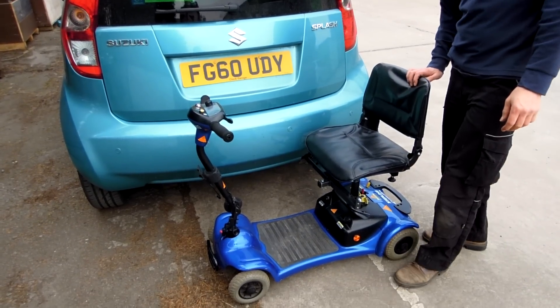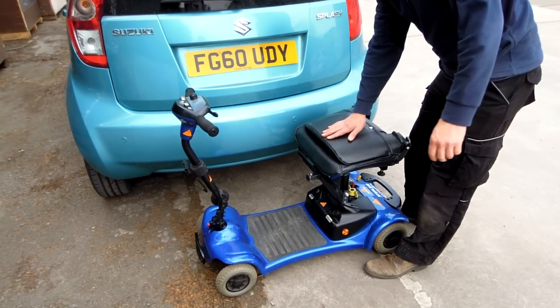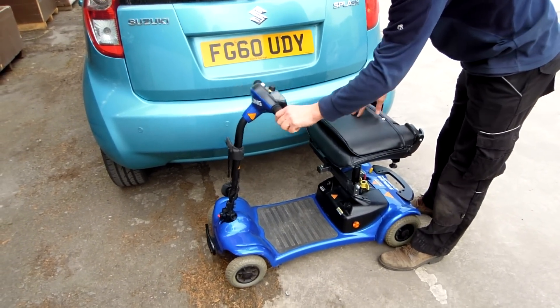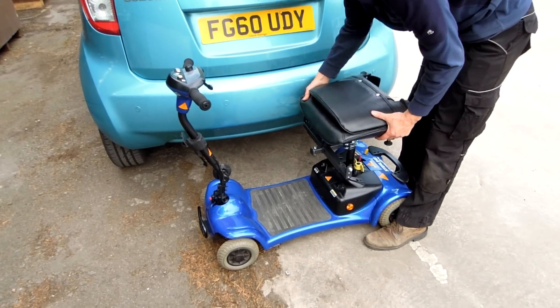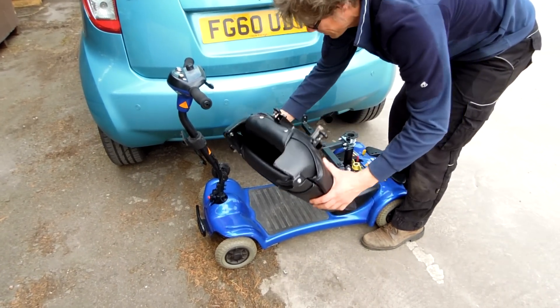Alright, this is the 80kg auto chair folding hoist. I'll show you how to operate this. I've got to take this — it's a little car so I've got to take the seat off on this one.